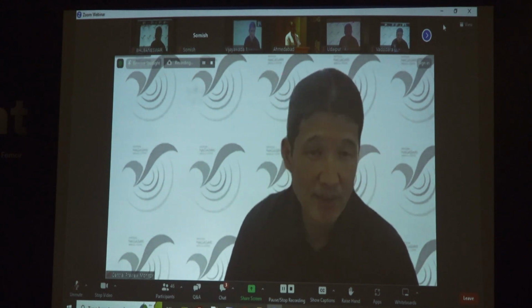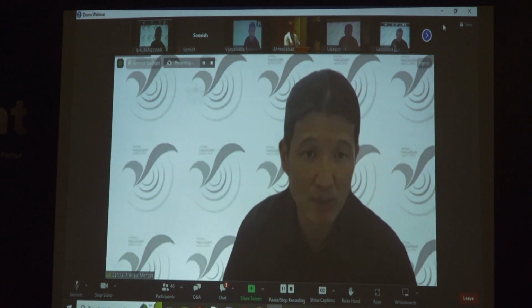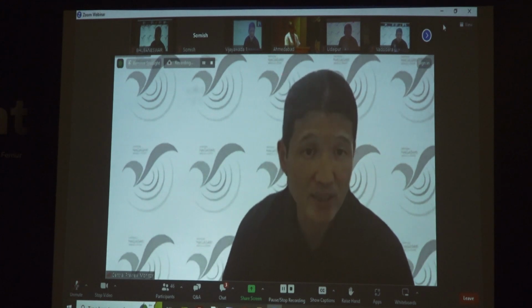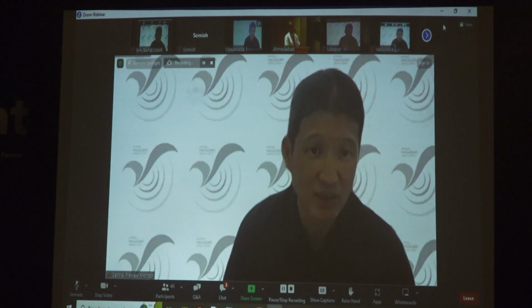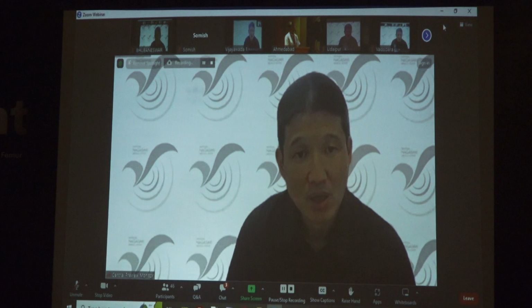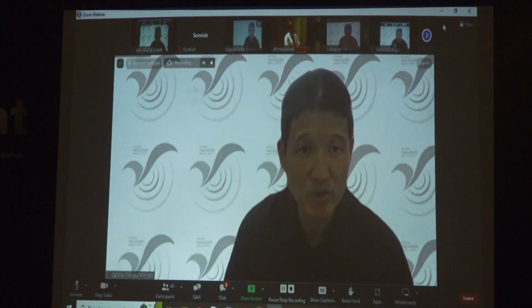I think it's more universal that the element should be fixed in a center position, and the biomechanical studies support that the off-center is much weaker than the center position. So what I do in my practice is always try to go center.